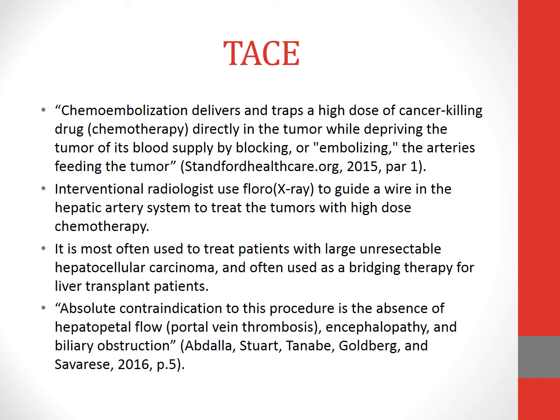So a TACE. What are we actually doing? Chemoembolization is when an interventional radiologist mixes a high-dose chemotherapy with embolization particles. What's actually happening is the IR physician is embolizing the arteries that feed that tumor. It's very similar to a uterine embolization when we treat fibroids, except in this case, we're using chemo with it.